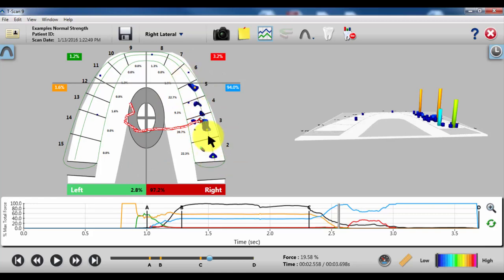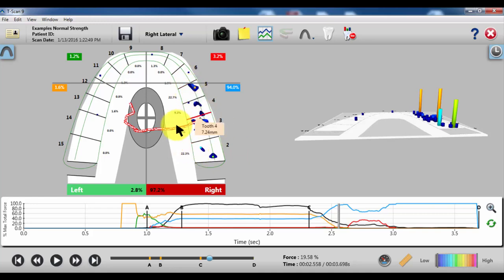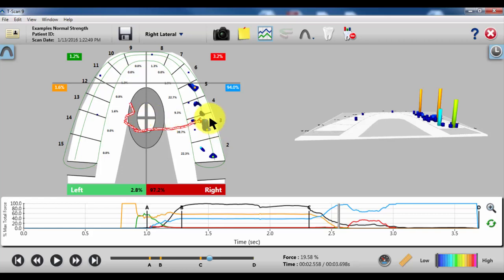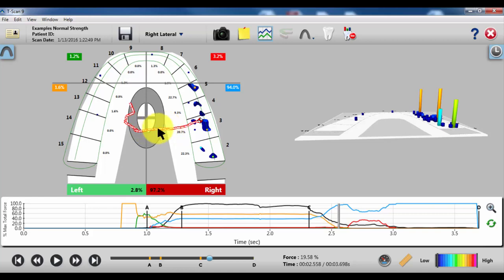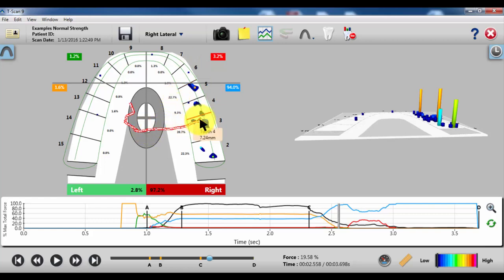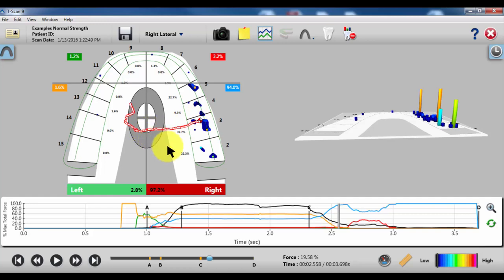You might go in there and adjust 2, 3, and 5 away. That should prevent this pull towards the right side, this group function, and at the very least shorten it so that when the person begins to pull, the canine takes over quicker. It's a really good indicator of what needs to be done.